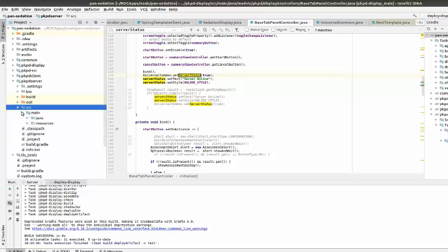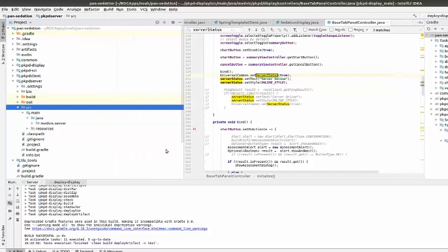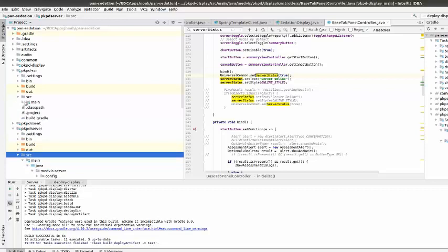This was put together over late 2016, 2017, extending a little bit into 2018 as the company asked for more features. So it started just with the basic display, then we moved on to the client and the distributed application with the server. Then they introduced more sophisticated models. So the models are in this module here. This is the scientific module, if you like.